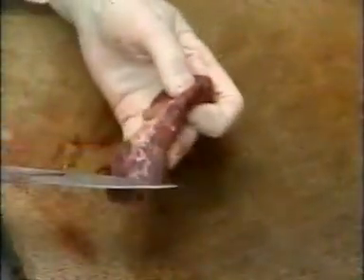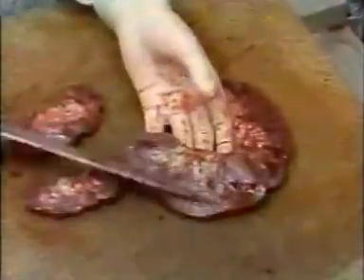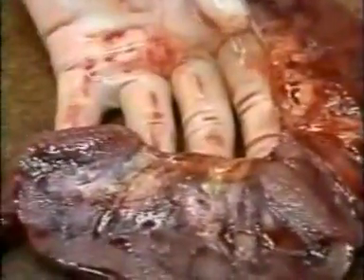What she's seeing is that there's marked thinning of the cortical tissues and portions of the medulla. Really very different. Now, see how much more full and thick the tissues are in the uninvolved kidney.